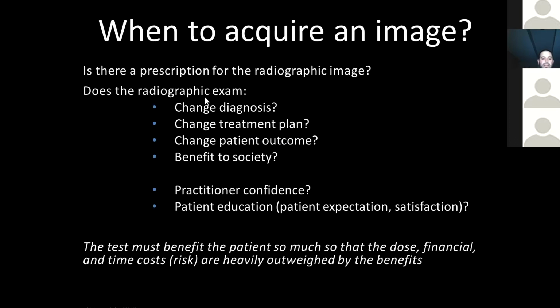And commonly, they'll fall back on this one. Well, I will get an image of this particular patient and it might change my diagnosis. If it still means I'm going to do the same thing, meaning it does not influence my treatment plan either way, that image isn't worth acquiring. Okay, so just changing a diagnosis alone is not a reason to acquire a scan. It has to influence your treatment plan or help you make a treatment decision somehow.